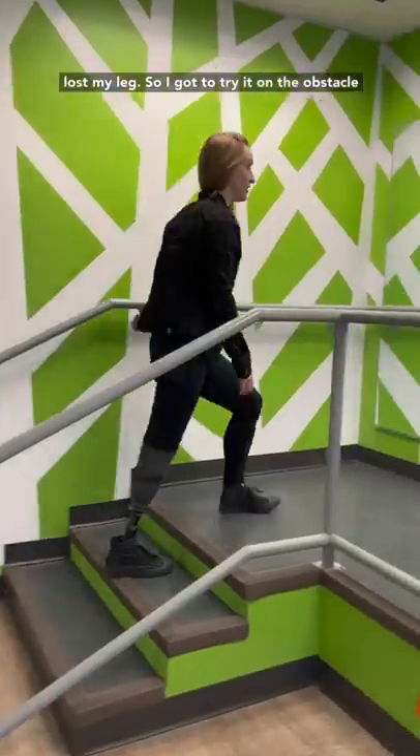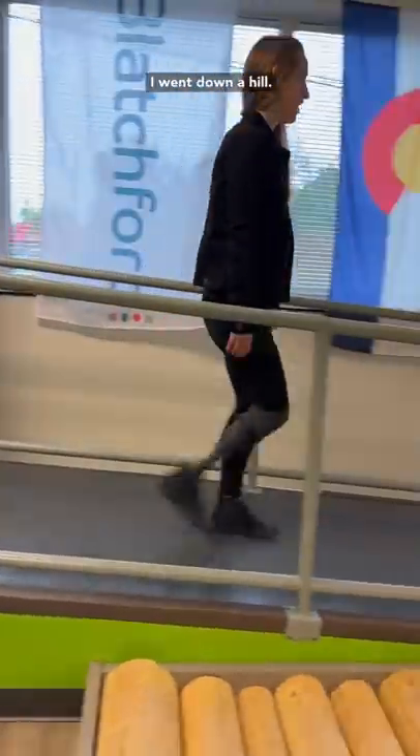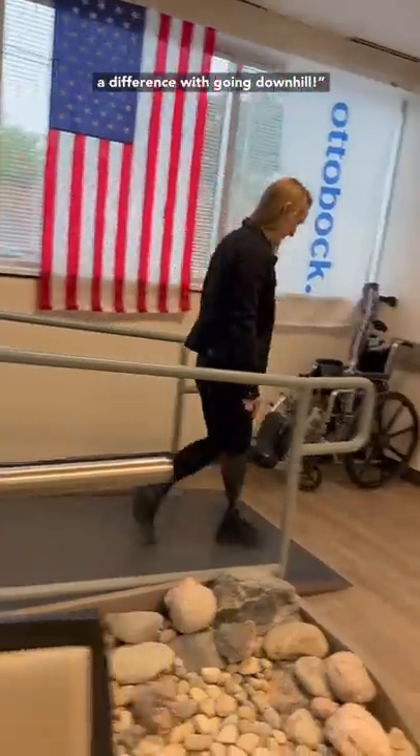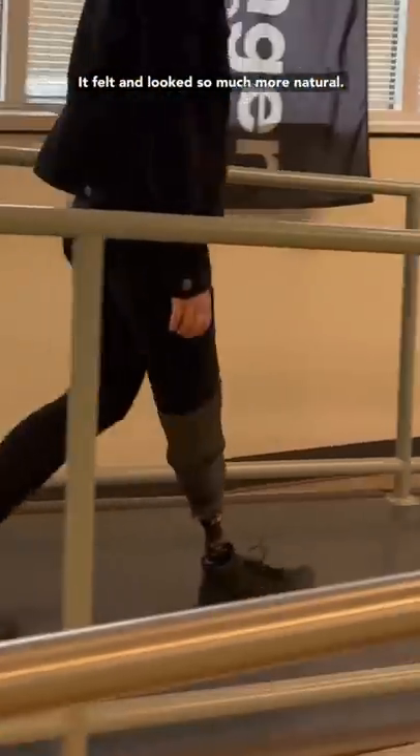So I got to try it on the obstacle courses, up and down stairs, but where I really started to notice the difference was when I went down a hill. Oh my God, that makes such a difference going downhill. It felt and looked so much more natural.